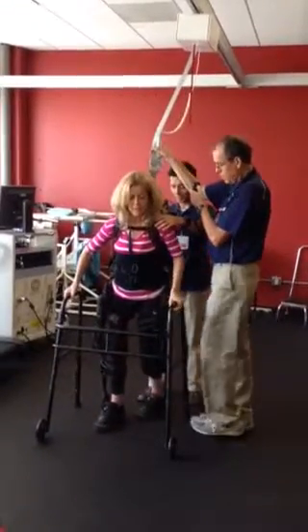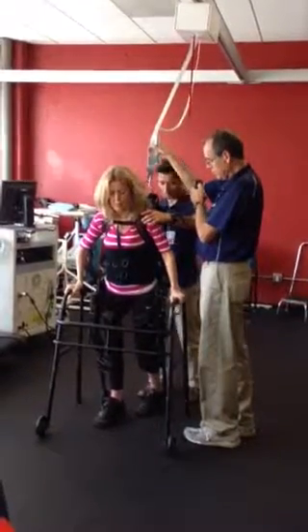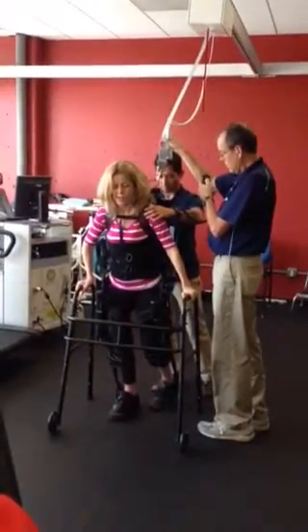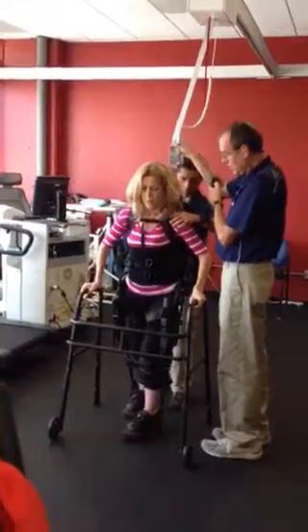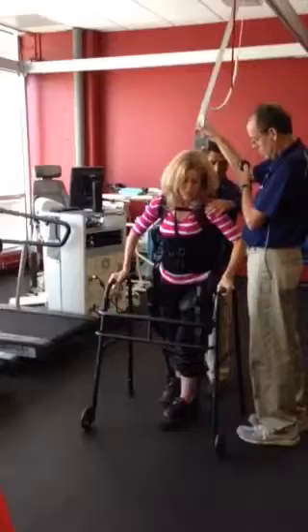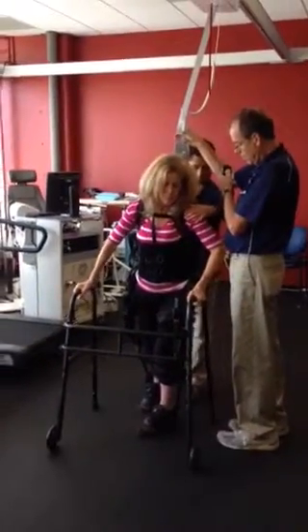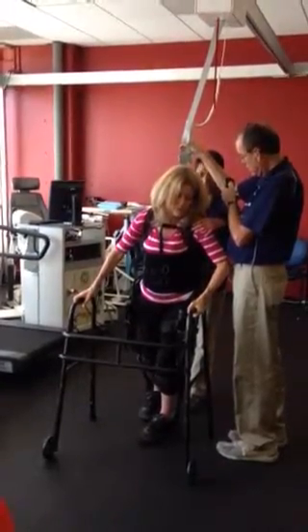Good. Walker. There you go — one more to the right. Right there. A little bit. Step. Good. See how you're back here with me? Shove your weight forward — left and forward. Hold it and left. I'm going to help you a little bit. Right there. That's where you want to be. Now hold it and step.